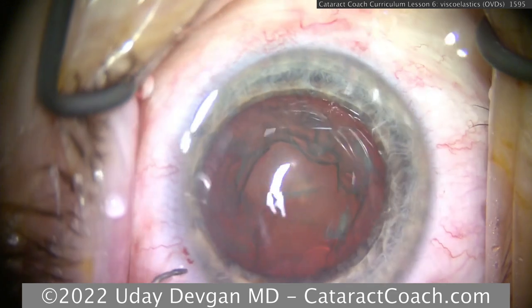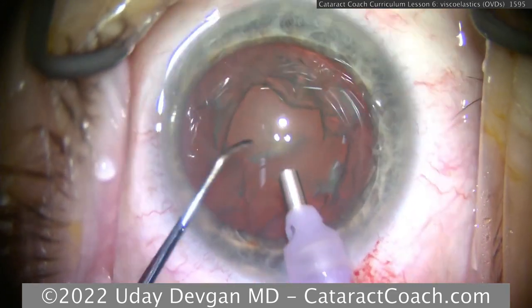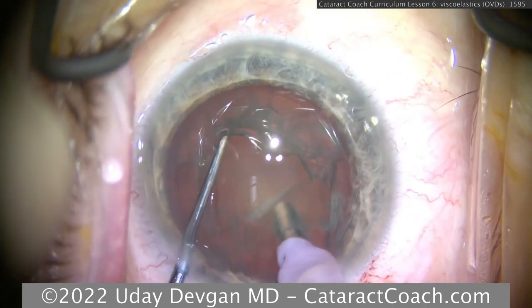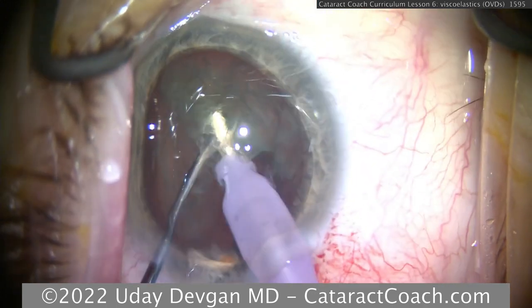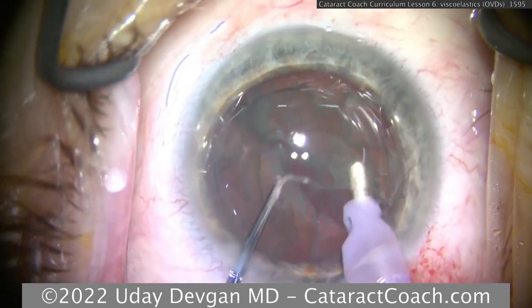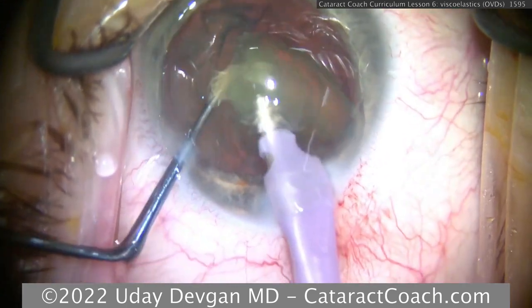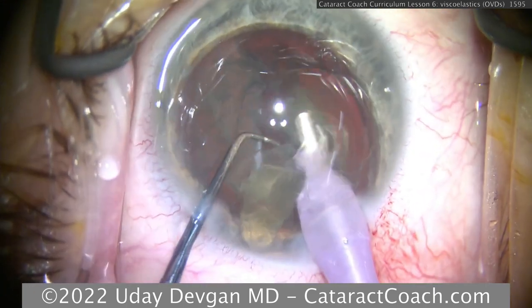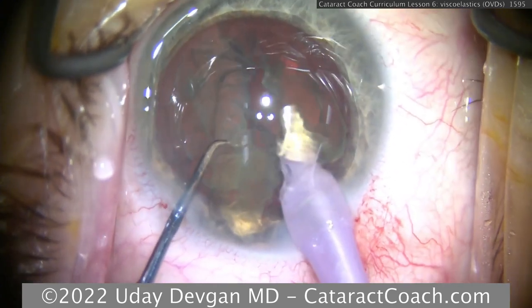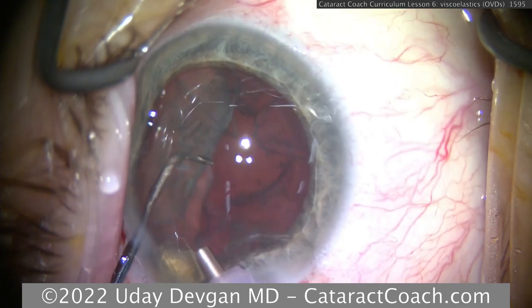So we're getting our phaco probe here, make sure the tip's the way we like it. And the chopper goes in the eye. For this nucleus, we're just going to do one chop right down the middle. There we go. That'll give us two halves. And this nucleus isn't so dense, so we can remove one half without any further subdividing or chopping. So the chopper here is just being used to keep the cataract pieces in front of the phaco tip. We don't want them beneath the phaco tip.